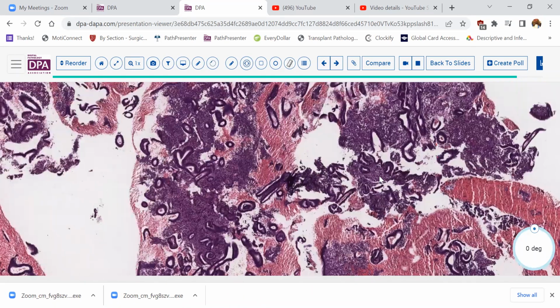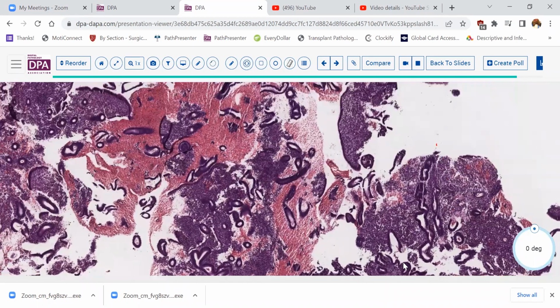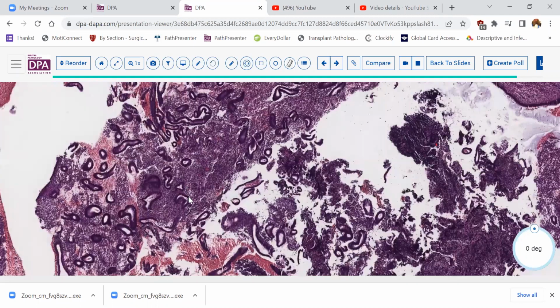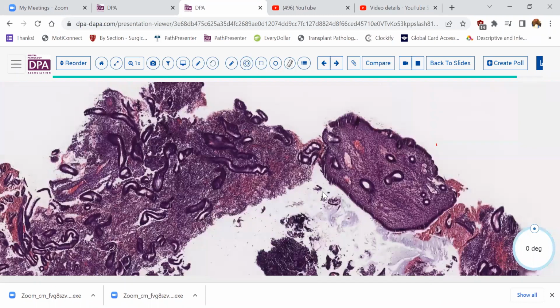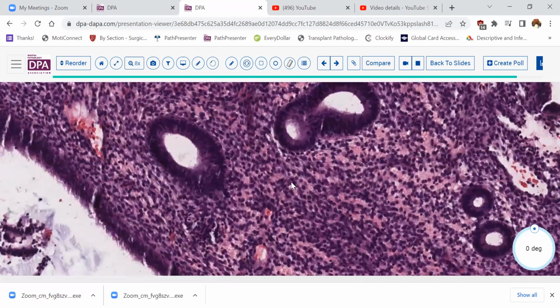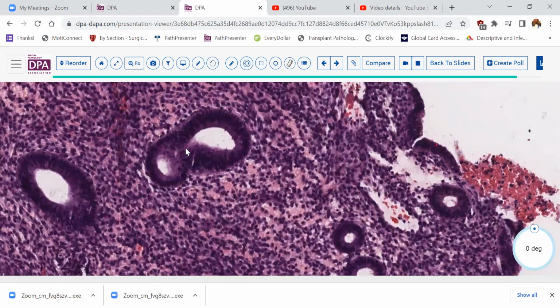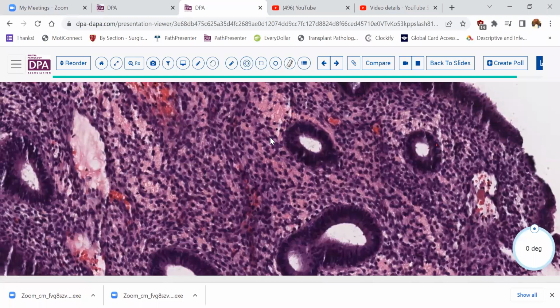So as you can see, this patient has a fairly bland or benign appearing endometrium. She has a history of abnormal bleeding, and they wanted to investigate why she might have that. Well, looking at these glands, they look sort of proliferative. They're widely scattered. They're generally round.